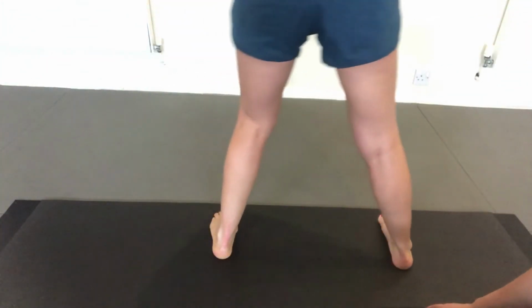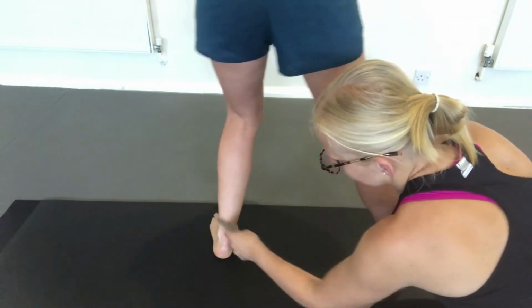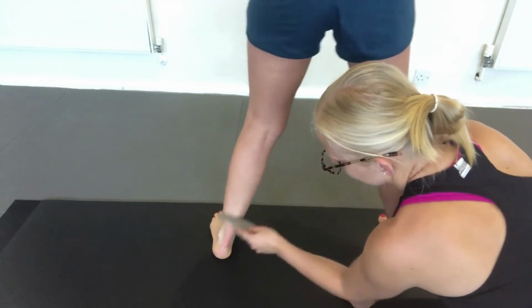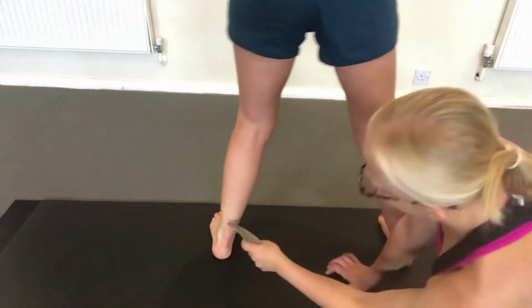You can also come into a side on position, so into a Cossack or a side lunge, doing the same thing around the posterior ankle and also the anterior ankle.